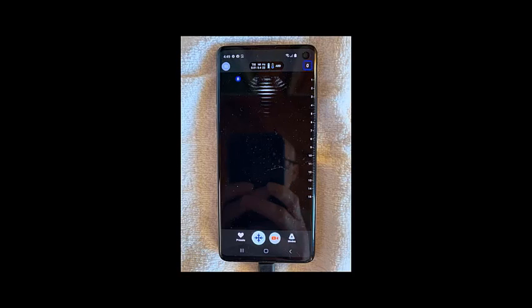Here are the instructions for how to use the BFLY. Here's the screen on the phone once it's launched. A few things to point out here. Well, the screen, the depth, it's all the usual stuff. The indicator is to screen left or patient right. Presets, freeze button. A couple of things you won't need to use or don't want you to use.